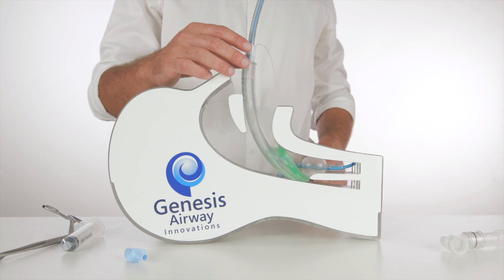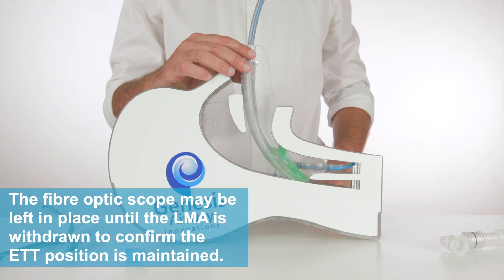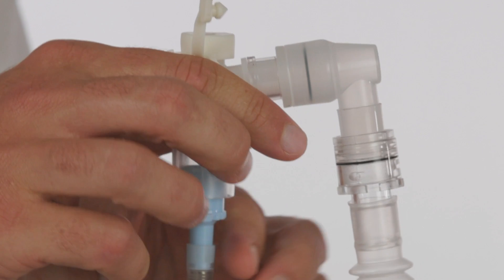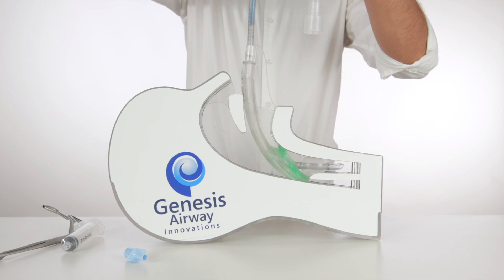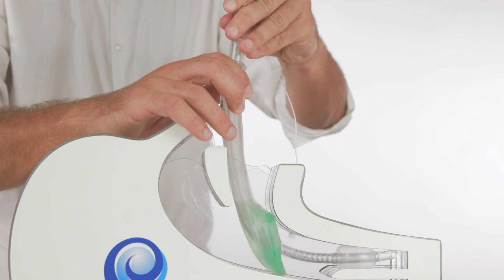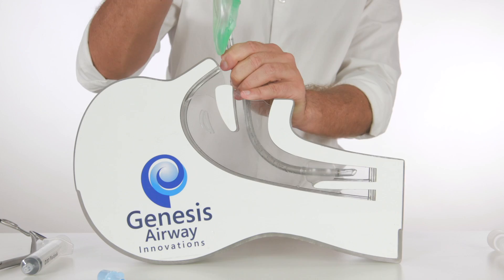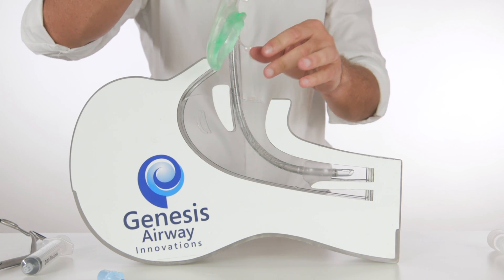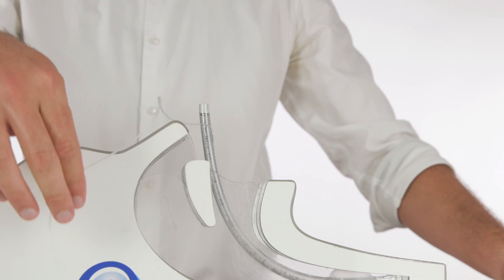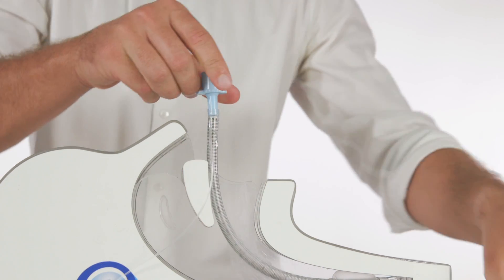The airway has now been secured with an ETT and the patient can now be ventilated. The fibre optic bronchoscope can then be removed and, holding the tube steady, the laryngeal mask can also be railroaded over the tubing until it is no longer in the mouth. The connector between the ETT and the airway tubing can be detached and the spare 15mm connector can be used to ventilate the patient.